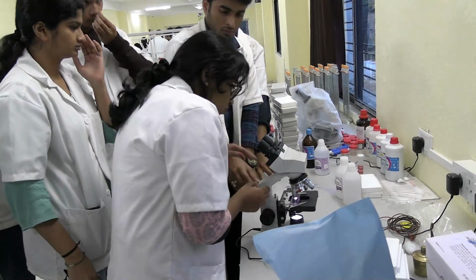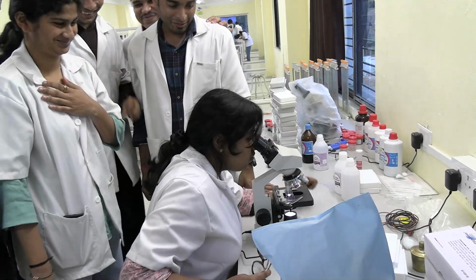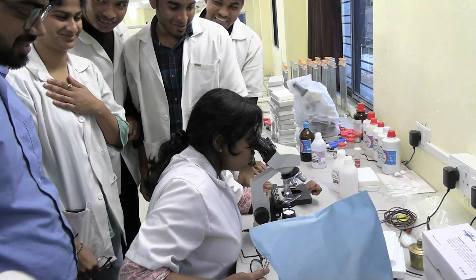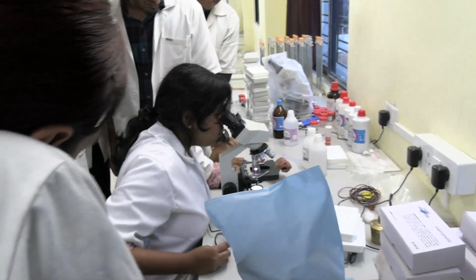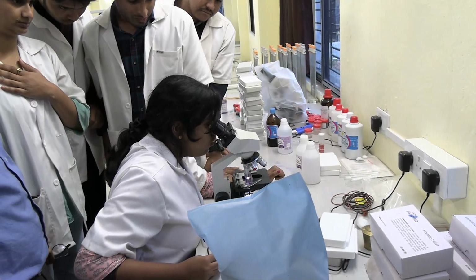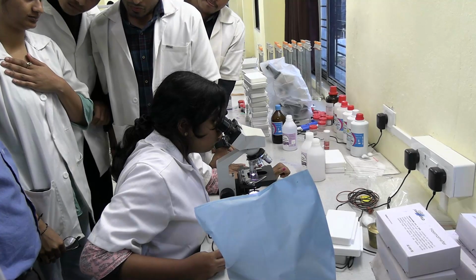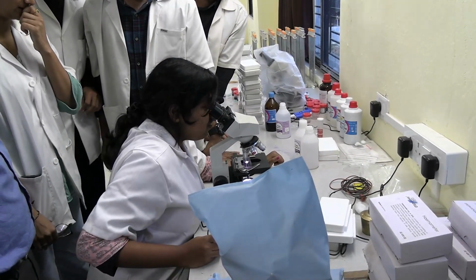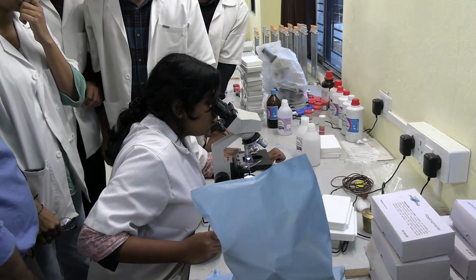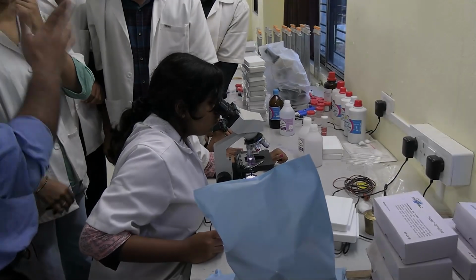Which cell is this? Which cell is this? Violet what? What color will the nucleus of an eosinophil be? What is the percentage of basophils in a cell count? 0 to 1%.